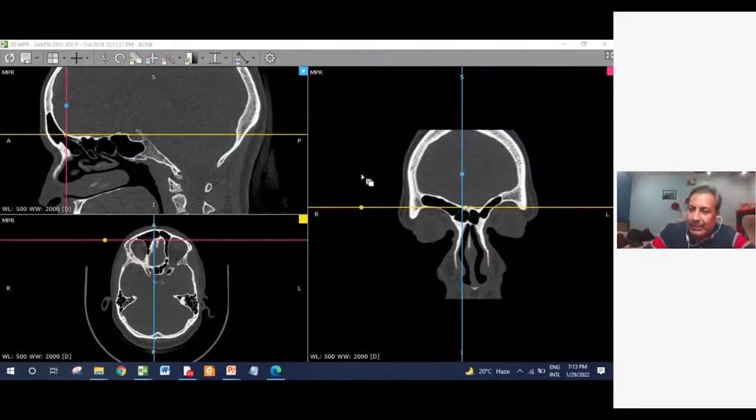The CT scan machine runs on the basis of the number of slices. The fewer slices you make, the less the machine runs, and the technician or the diagnostic center can save a lot of money by giving you fewer slices.